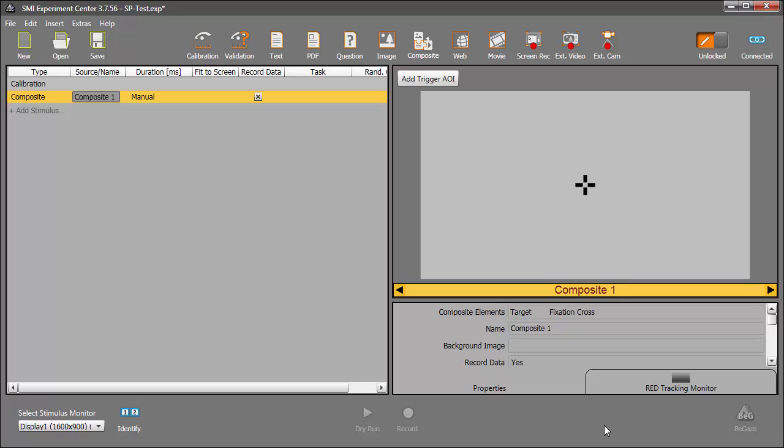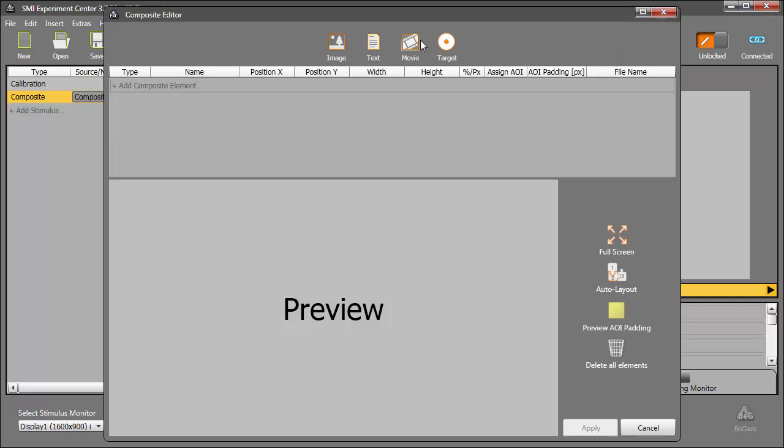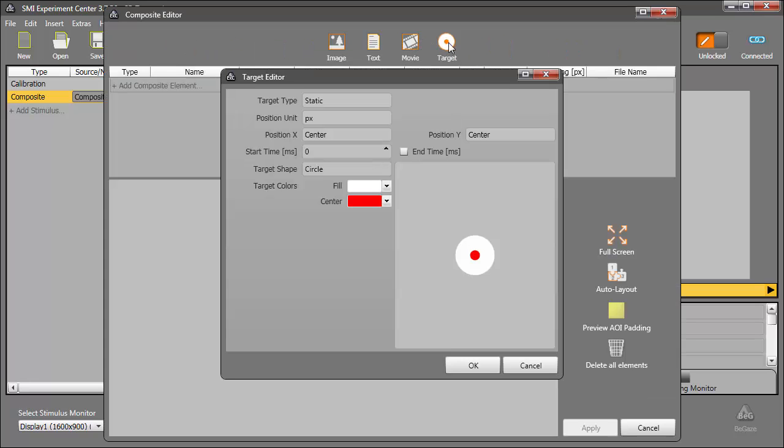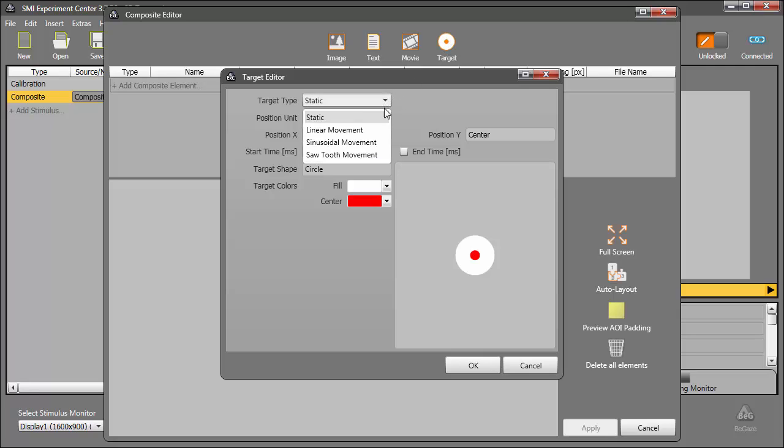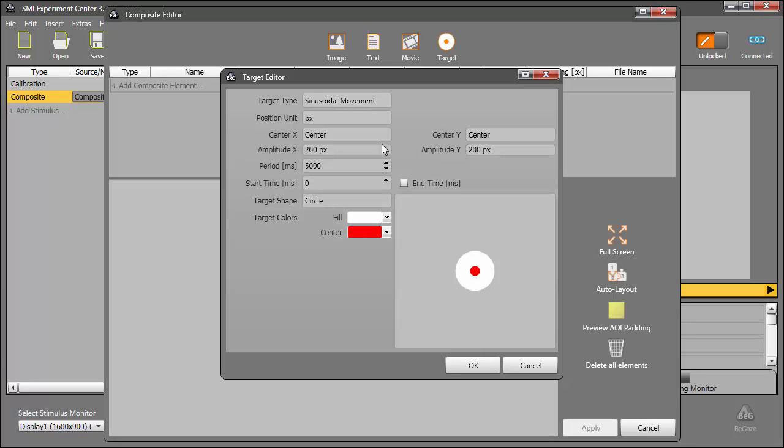Now, let's create another composite stimulus for our moving target. Click Composite, and then I'll click Target one more time. In the target editor, I'll now choose a different type, sinusoidal movement. As you can see, there are other movement patterns as well, Linear and Sawtooth. Choosing sinusoidal movement gives us a new set of parameters.